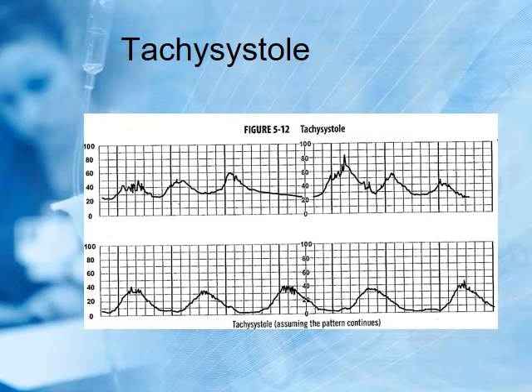How often is she contracting? There's one there, there's one there, there's one there, there's one there. It's almost tripling. You can almost see a tripling, but it's happening. Boom, boom, boom. That baby does not have recovery time, okay? Same with this one. Again, start, start, start, start. They're happening every 1 minute, 1.5 minutes, 1 minute, 1.5, I mean.